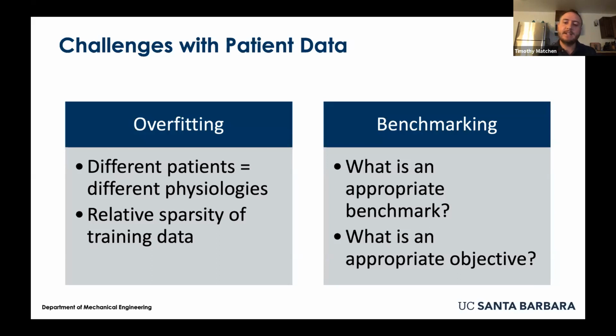So for example, if we see that it is likely that we're not going to see bursting activity, even if stimulation is turned off, that can be an indicator that we can just turn off the stimulation and not use it in this time step. And then when we see that we need to turn it back on to maintain the state where we don't have bursting behavior, then we can turn the stimulation back on as well. So that was what we decided to do in terms of the objective.